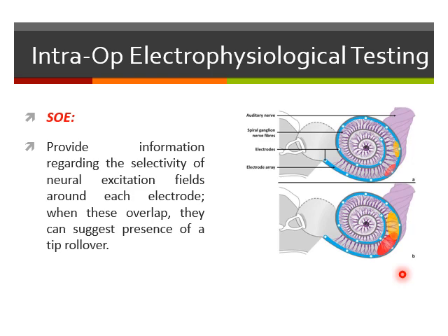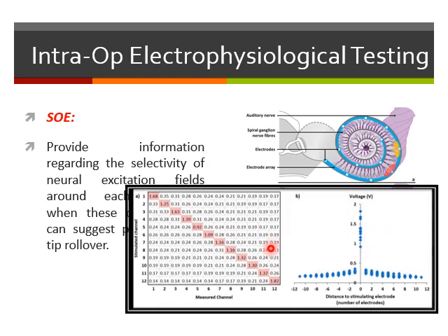So, upon stimulation of a certain electrode, usually this overlap decreases as the other electrode is farther away from the stimulated electrode. In other words, if I stimulate, for example, electrode number 1, then by logic I can expect that it usually reduces the electrical field that propagates to stimulate the spiral ganglion.